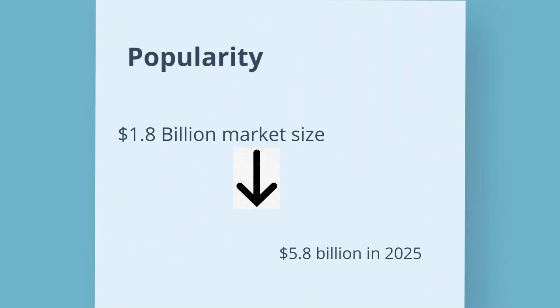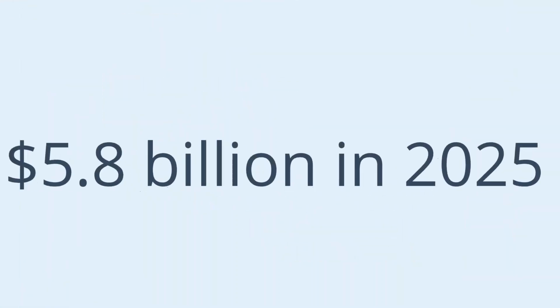The popularity is skyrocketing with clear aligners. I think this is in large part due to better digital technology that is allowing more laboratories to produce these. In 2018, the market size was 1.8 billion, and that is expected to grow to 5.8 billion by 2025. That's a huge growth.